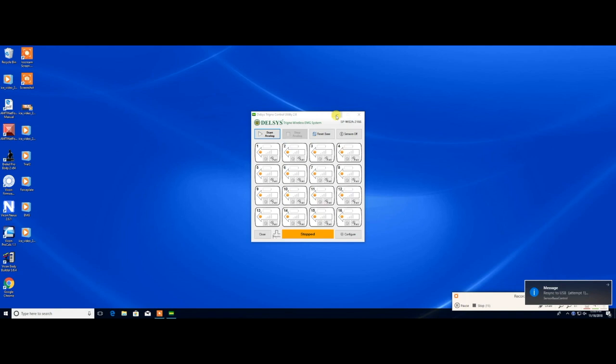Once the sensors are paired, click on the start button. This will cause the base station to start sending out data from the EMG sensors. The control utility must be running at all times while collecting EMG data. We are not going to collect data in this video, so we will leave the DELSYS-Control utility off.